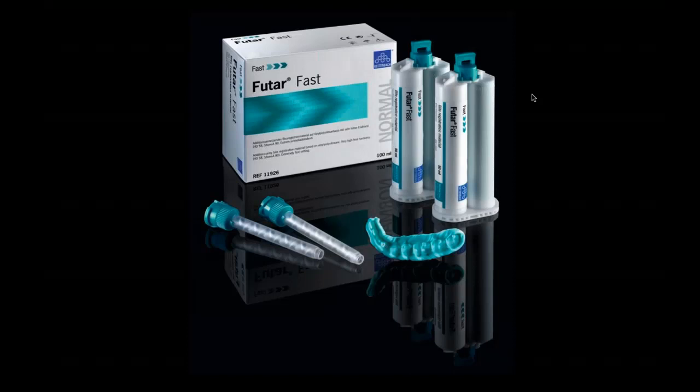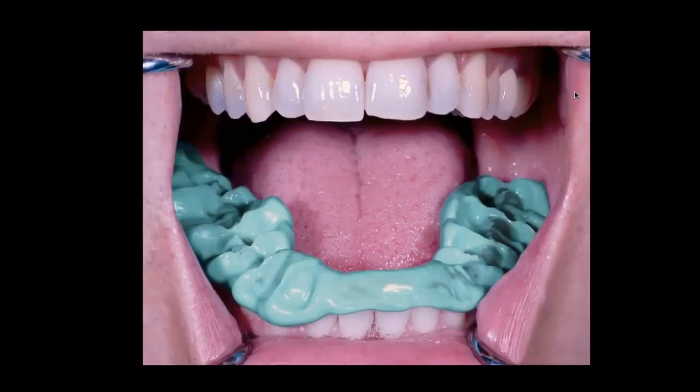The Fast material sets quickly. When we get done with our preparation, we have to take a bite record. Or if you're doing a diagnostic model, you do a bite record. So this is the material. The bite registration material is called Futar. This shows it in the mouth.